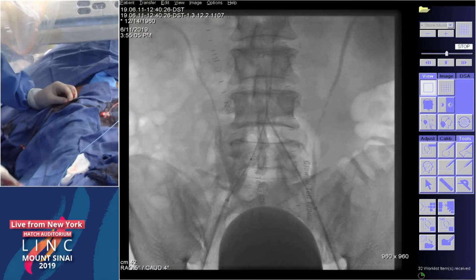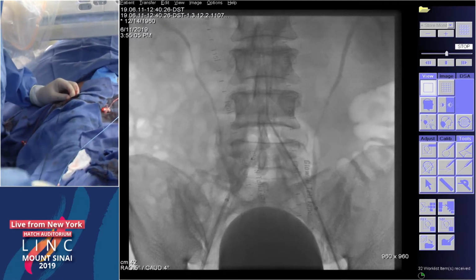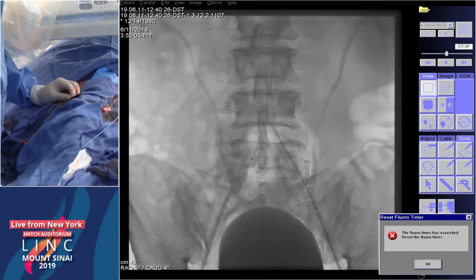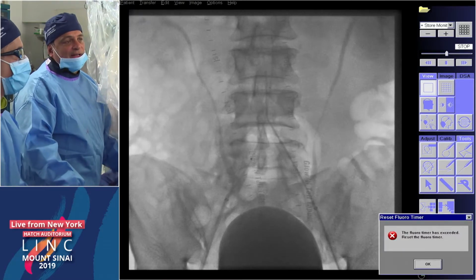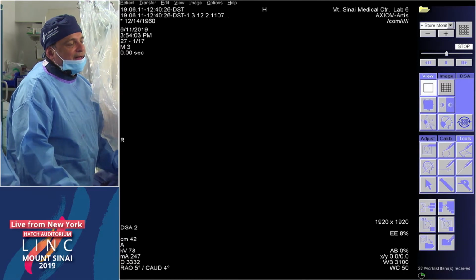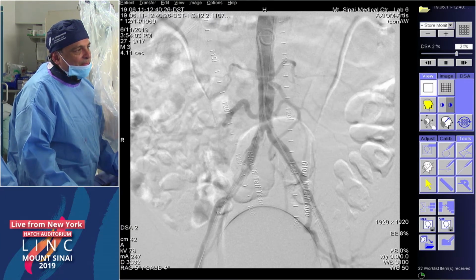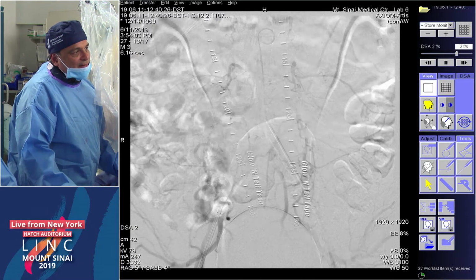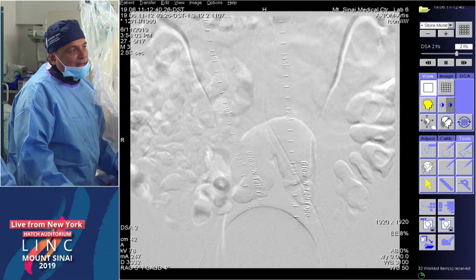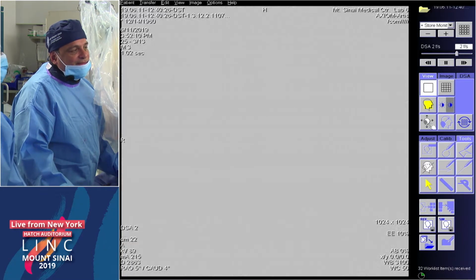What do you think? PK, just plain devil's advocate, would you consider not stenting in the situation where you have substantial luminal gain with just simply the Shockwave? That's a great question. Let's go to the angiogram. So on the left, it looks like we have a nice expansion without much dissection. On the right, that vessel is in tatters. Sure, go to my injection of the right from the bottom. So to answer your question, I think on the left, I would agree with you.